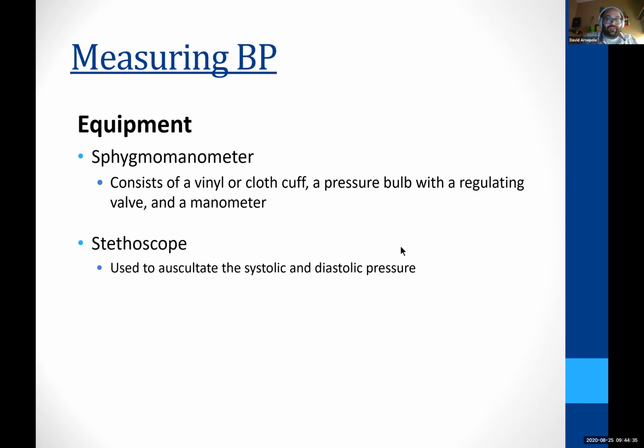That first little bit would be checking your systole. And when the pressure completely goes away, when you're listening to it, that would be diastole. That's your upper number versus your lower number. Bridget, we're talking about central lines and arterial lines specifically. But again, don't worry about that right now. I'm just introducing it to you.